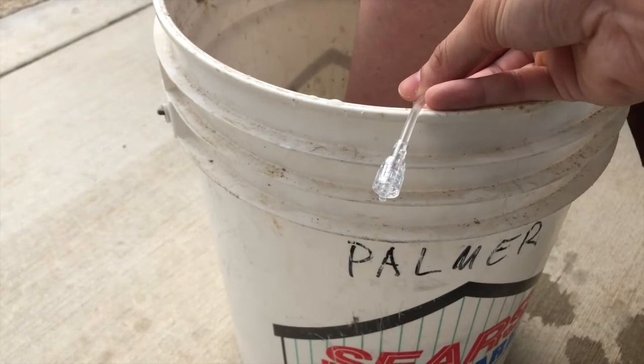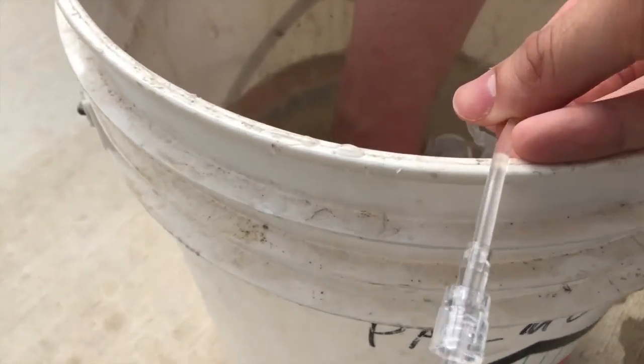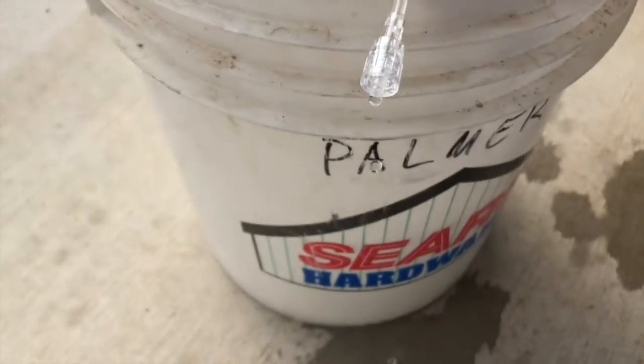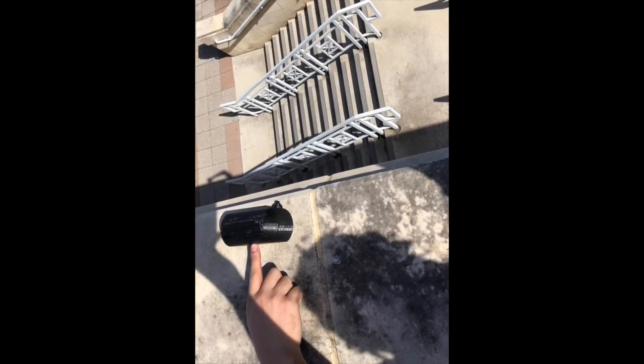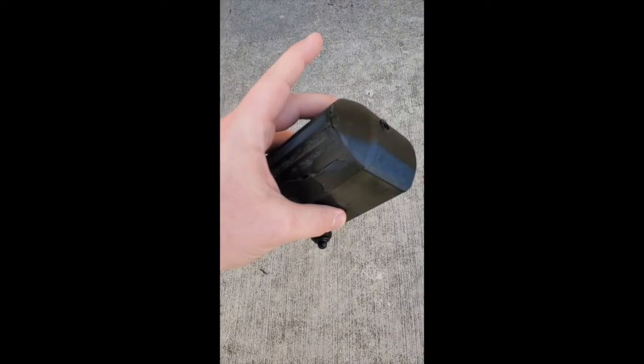Also, while fully submerged in depths up to 1 meter, the PIVP will consistently operate. We only observed structural failure after a fall more than double our test height. The device visibly cracked and split, exposing the internal components. Even so, it fully retained the ability to induce flow and to sense a lack thereof.